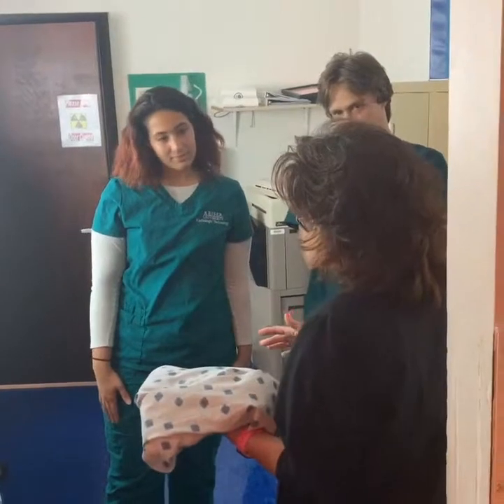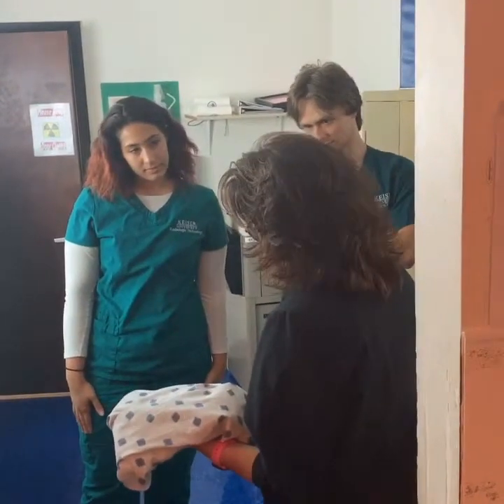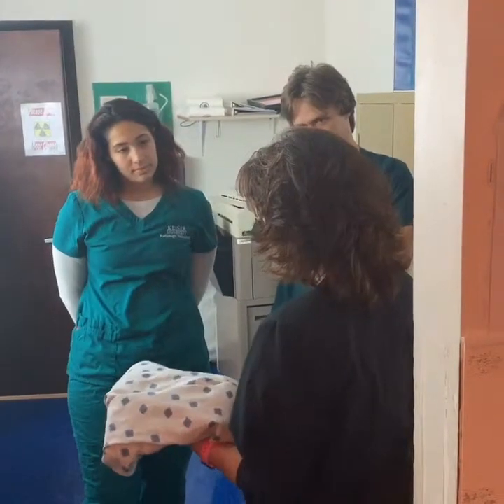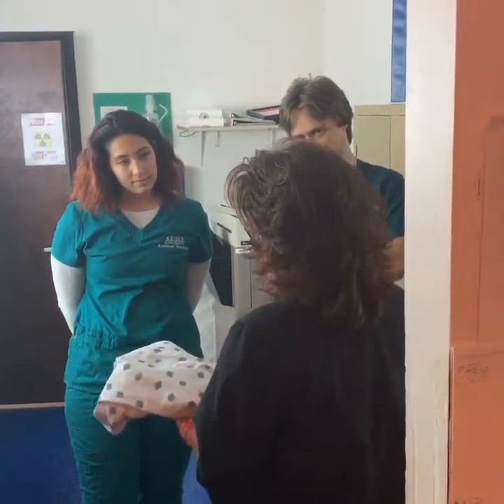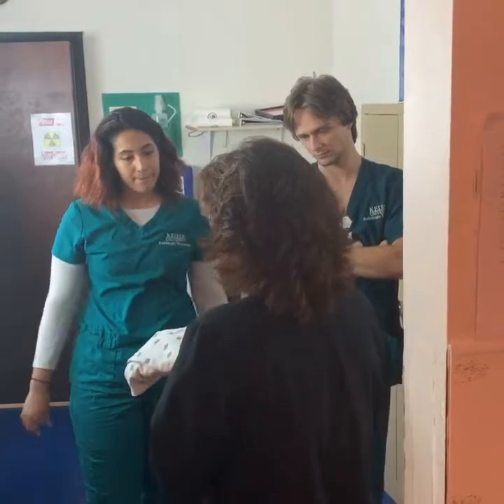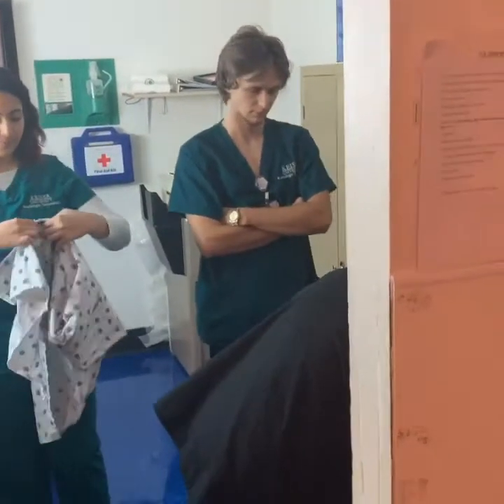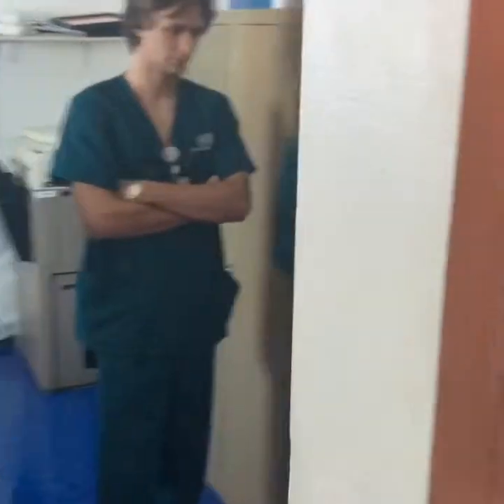So what I'll need is your pants off. Probably shoes and socks can stay on. If you'd rather take your shoes off, you can leave just your socks on. This gown can go on open to the back, and I'll let you change, and then I'll come back and get you in just a minute. Okay. All right, so while she's changing, we'll set this up.